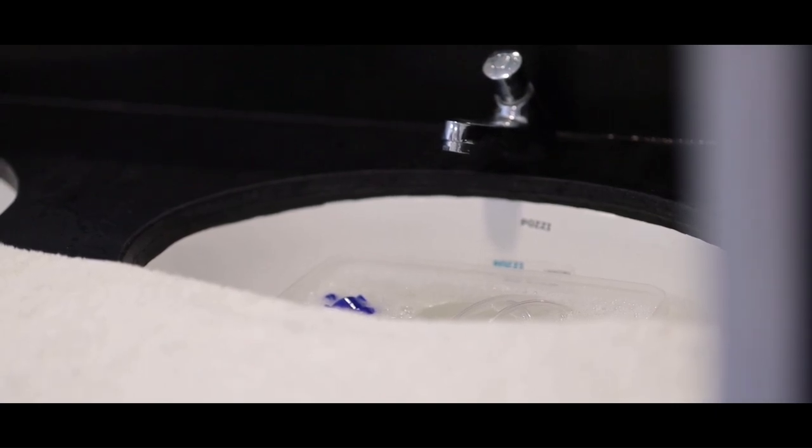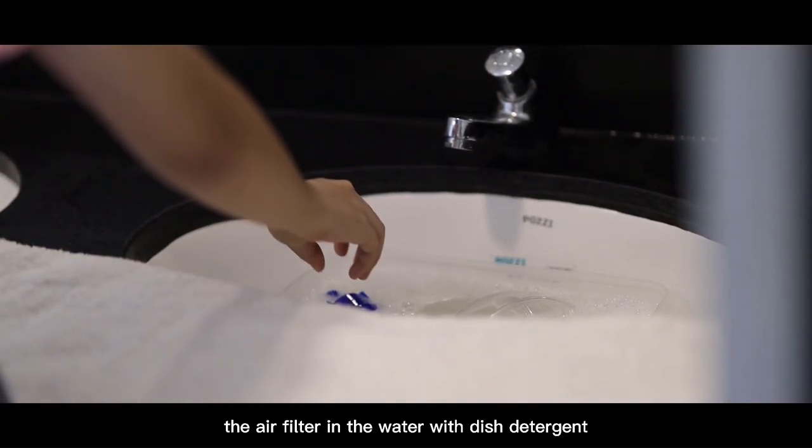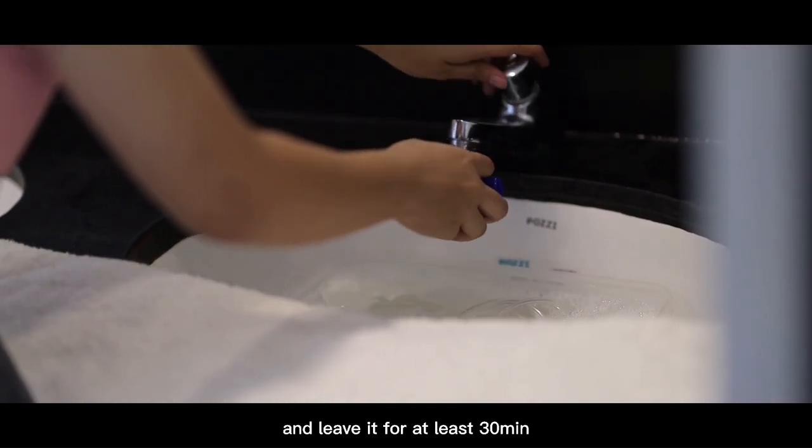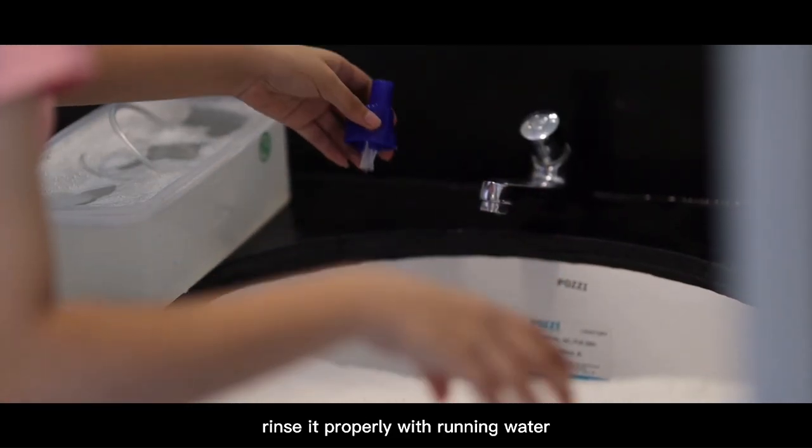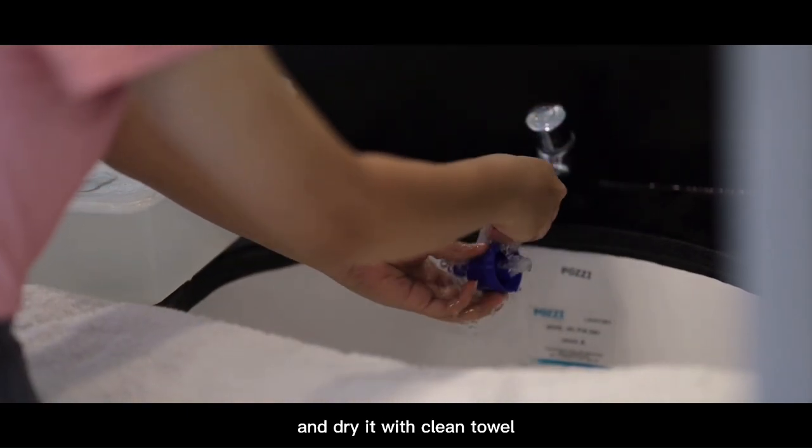For maintenance and care, put the air filter in water with dish detergent and leave it for at least 30 minutes to kill the bacteria. Rinse it properly with running water and dry it with a clean towel.